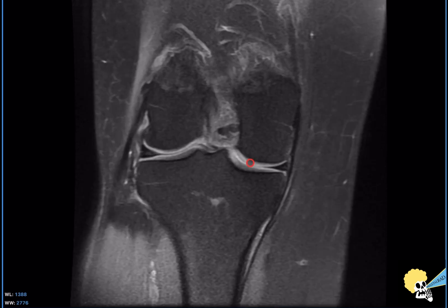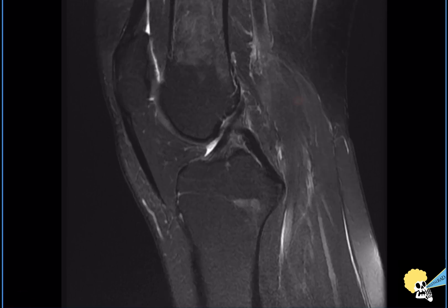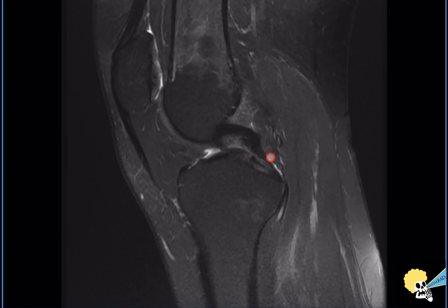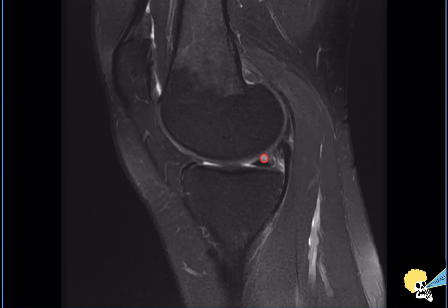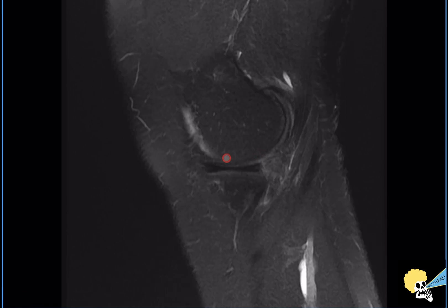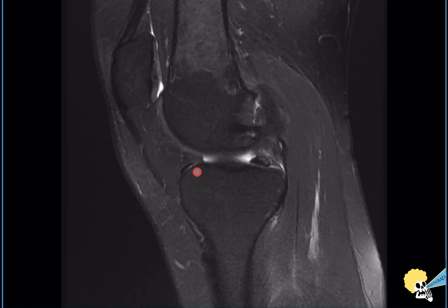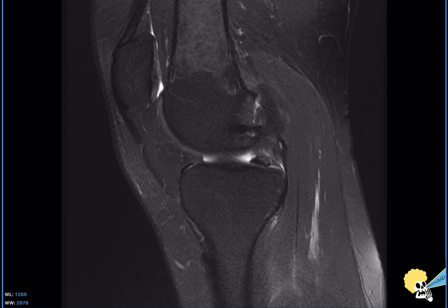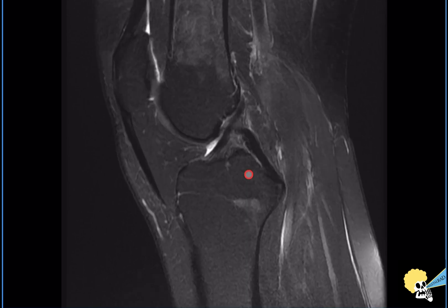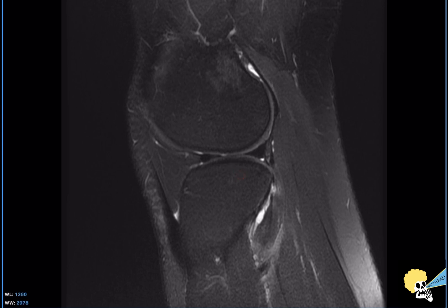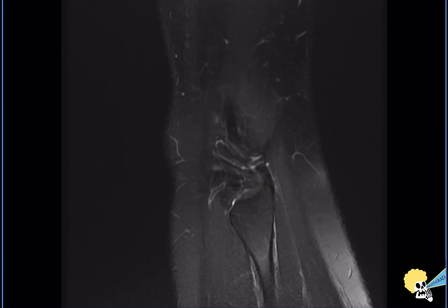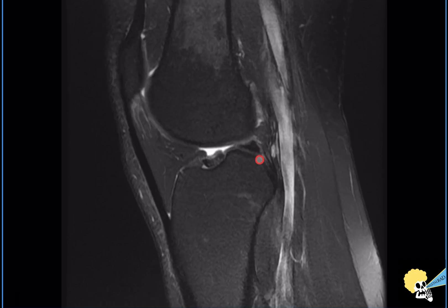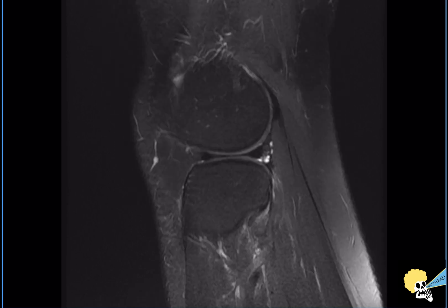Now I go to the menisci, starting with the sagittal proton density or T2 with fat suppression — hopefully a proton density. I go from the roots, which are really important to evaluate, all the way to the body and the posterior and anterior horns, making sure there's no signal abnormality in both the medial and lateral meniscus. The medial tibial plateau is slightly more concave, the lateral is more convex — you can always look to the periphery and see the fibula to confirm you're in the lateral tibiofemoral compartment. Make sure you evaluate the roots of the meniscus very well, because many tears that people miss are in the roots.